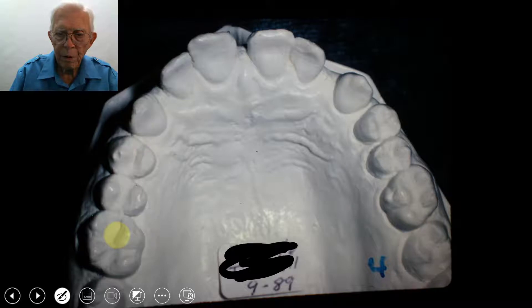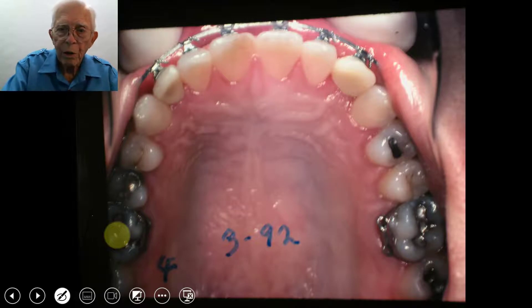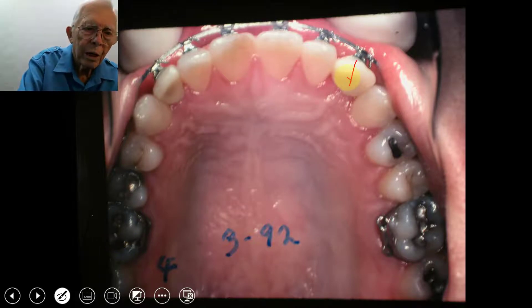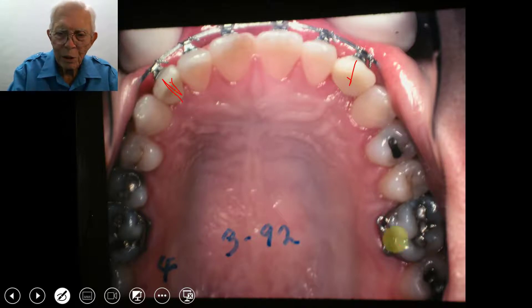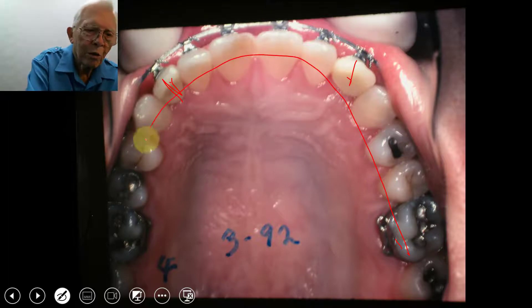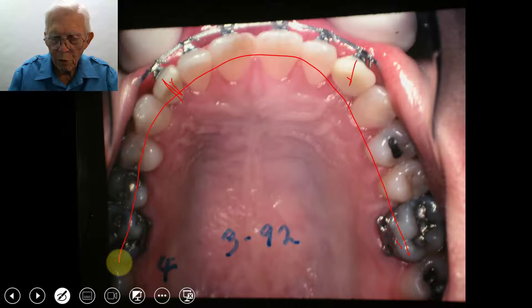There are the upper teeth, and there we are with the artificial teeth — we've got one here and one here. It's hard to see them sometimes. That closed all this up, and her tongue structure fit all of this. She has an oversized tongue, but she had the jaw and space in her facial structure for it to work out.